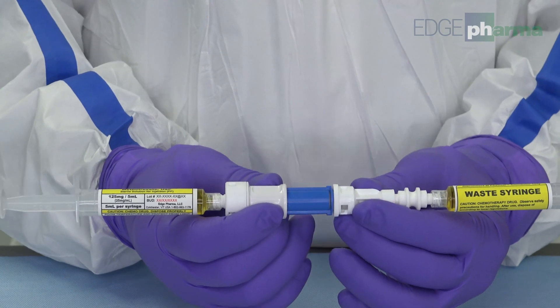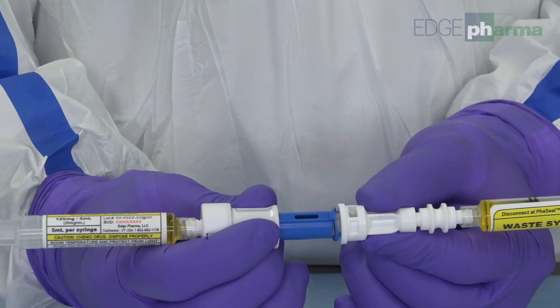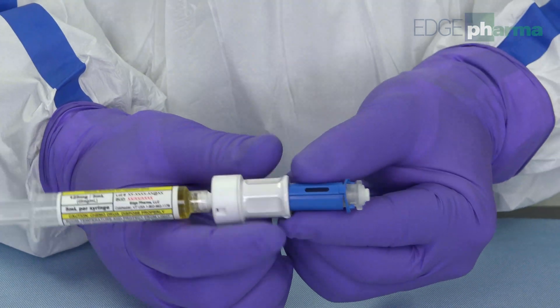Disengage the closed system transfer device. Disconnect the waste syringe. The waste syringe can now be disposed of in a hazardous waste container.